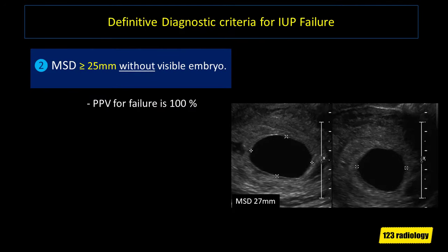This gives us the second definitive criteria for pregnancy failure: a mean sac diameter of 25 mm or greater with no visible embryo, with a 100% positive predictive value. As you can see on this image, the mean sac diameter is about 27 mm with no visible embryo within the gestational sac, indicating definitive early pregnancy failure.